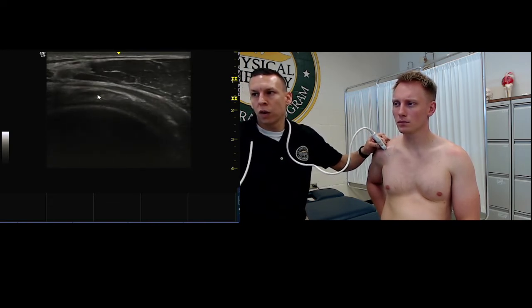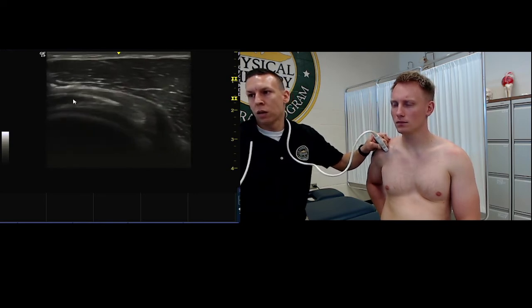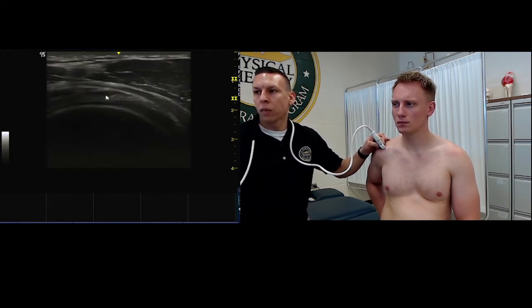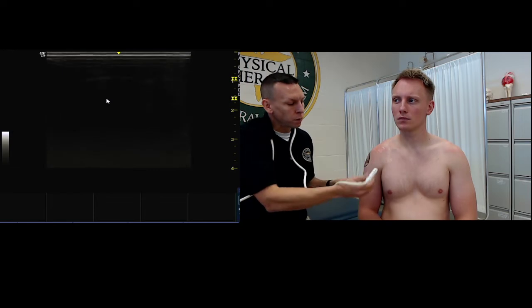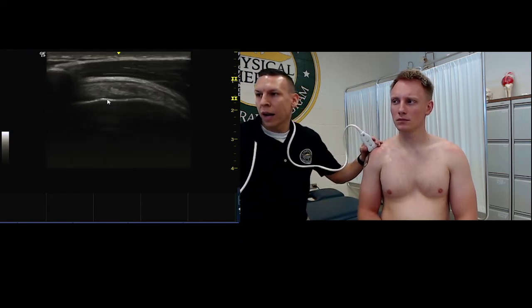If you keep moving up, you might run into some muscle blending in with some of these. Like it looks here, this more hypoechoic region. That's muscle of the rotator cuff. But yeah, so that's the supraspinatus. We can take the shoulder and move them out of that position. From here, we can also look at it dynamically.